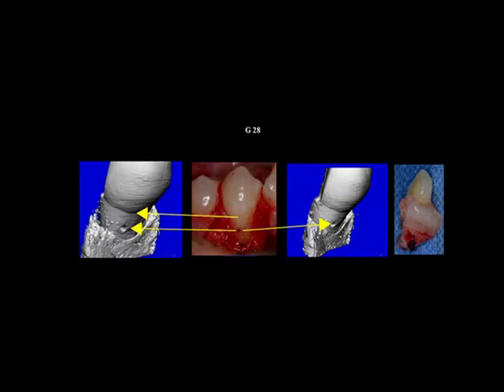These micro-CTs blow me away. It's such cool technology. So you're looking through here, and here is the bone underneath that. Now, this little dot, that's the dot at our original free gingival margin, and here, of course, is a CEJ. So we've got root coverage all the way to the CEJ. Now, you can't see this dot because all of this bone has grown up over this root surface that was previously exposed.